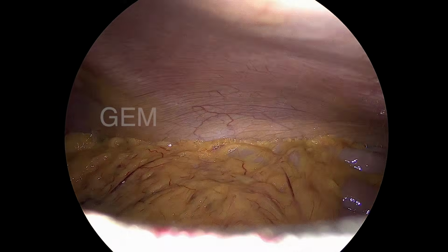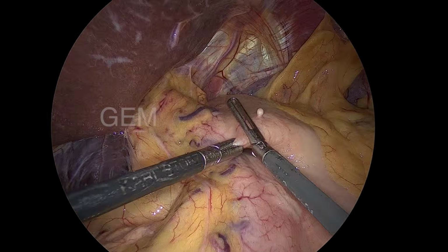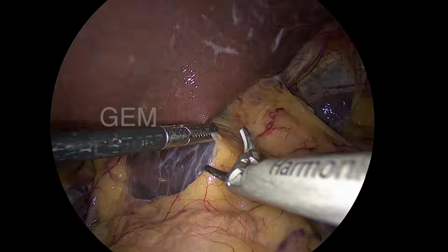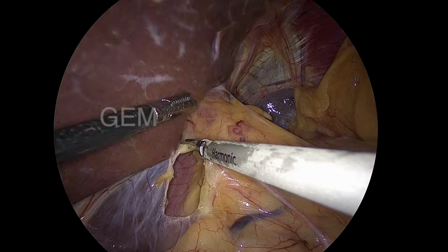This is the left hand working port. This is the one for retraction. In this case, already the liver is retracted. I put the port a little later. So, by retracting the stomach, the gastrohepatic omentum is being exposed, and I am going to divide the window, Kushner's window, and so this is a lateral approach.